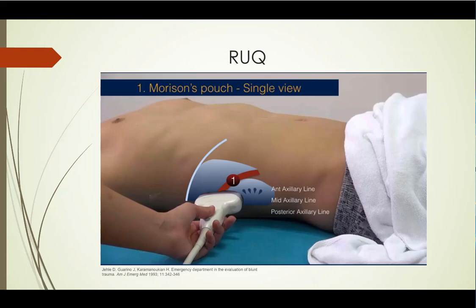Here's a demonstration of what we're doing. This person is using the curved transducer, which is fine — that's my preference. You can also use the phased array or the cardiac probe, which can see between the ribs a little easier. Sometimes with the curved array you have to tilt the superior or inferior probe up a little bit to wiggle around and see between the ribs.